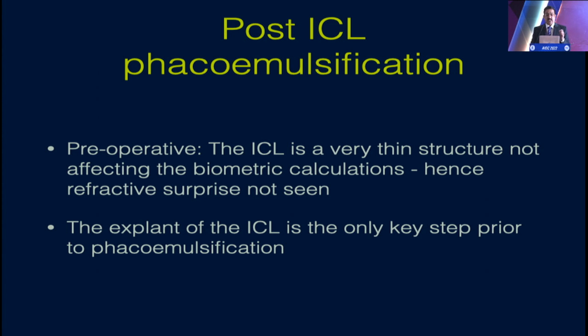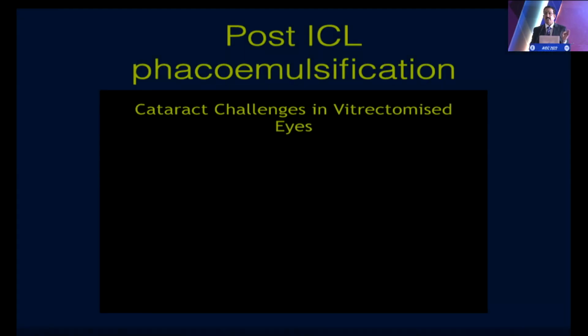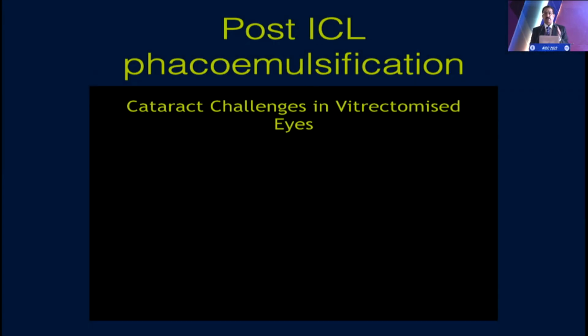The post-ICL phacoemulsification, the ICL is a very thin structure, and there has to be no evidence of any deviation from the biometric calculation that you would do for a normal patient.